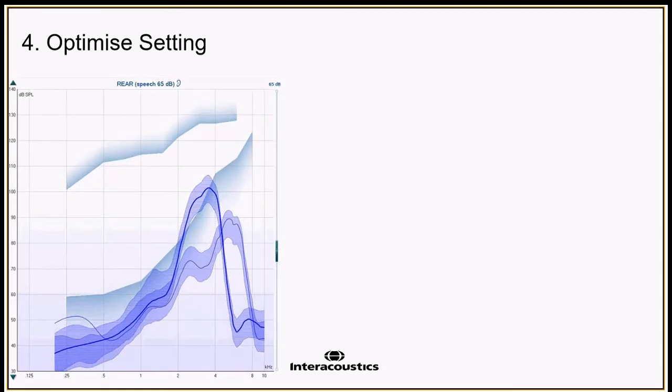So within different hearing aid manufacturers' software, they have settings to adjust the frequency that you're moving it down to. As we identified there, it's good to move it to 3.8 kilohertz, but there's typically settings to move it to that or lower. And you can also adjust whether you want to increase or decrease the strength of this sound. So you can make this louder or softer based on how the patient feels that is helping them or not helping them.